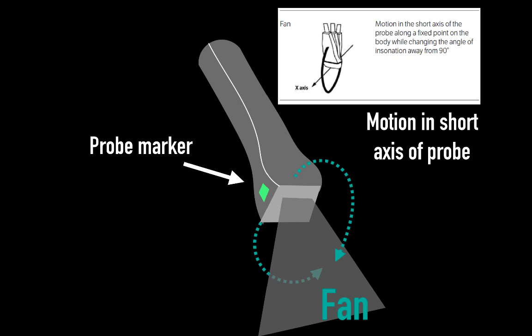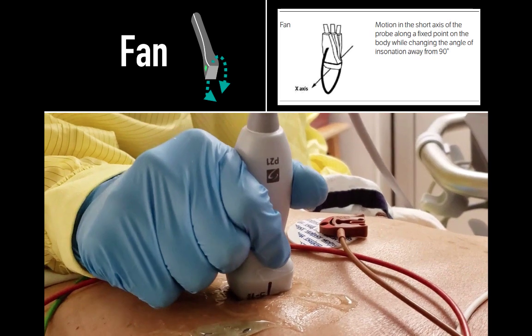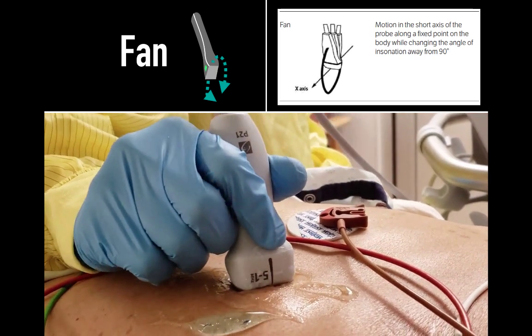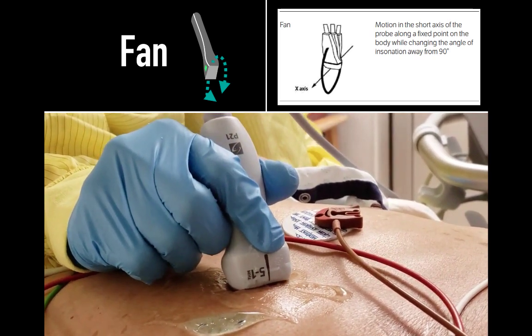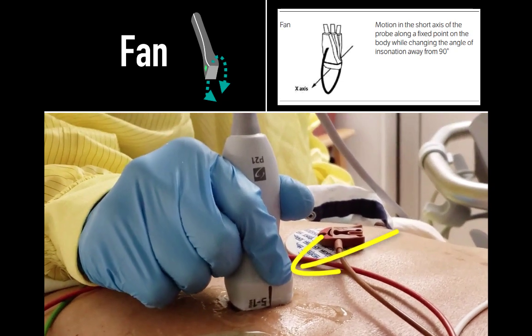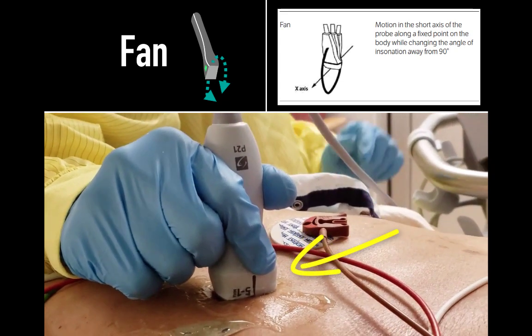This motion is in the short axis of the probe. But again, the probe remains fixed on the body. You can see the demonstration here. You cannot see the marker, but it will be facing towards patients' right side. Now the probe is moving in the short axis. The word fanning describes the motion well. It is indeed much like wafting with a fan.